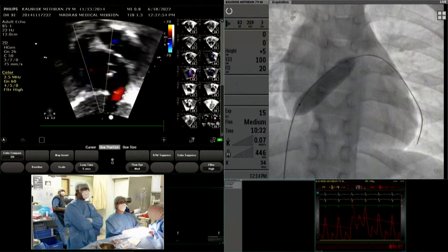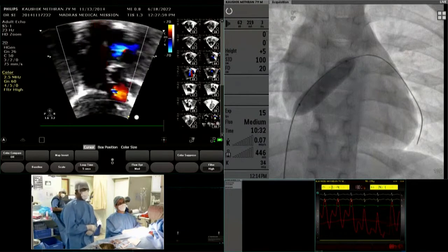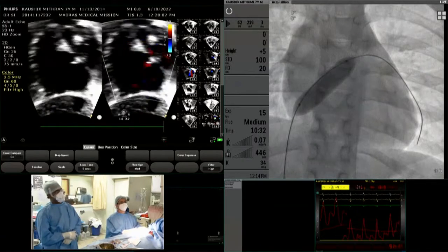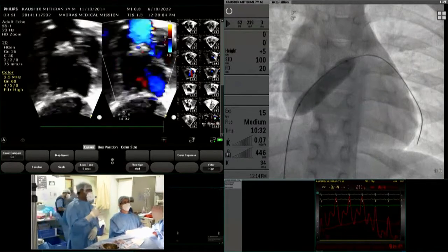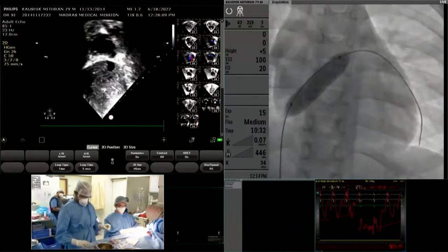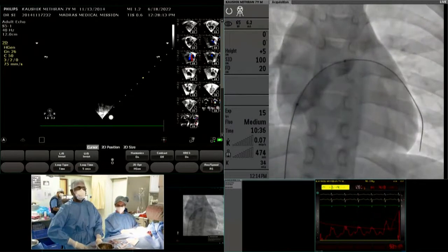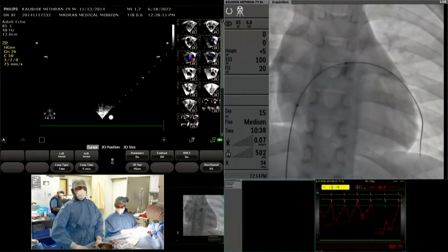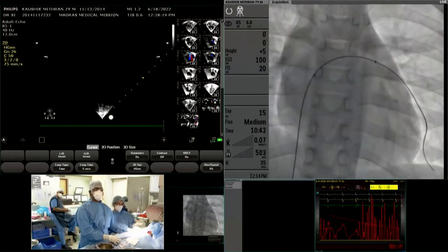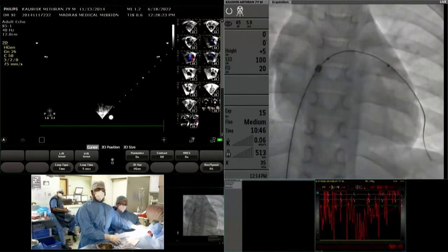Yes. What we'll do is, see, the RA pressure is not increasing. We'll just put in a 14 millimeter device and see. Prabhu, what is the recommended sheath for a LifeTech 12 mm and a 14 mm? Just see it and tell.